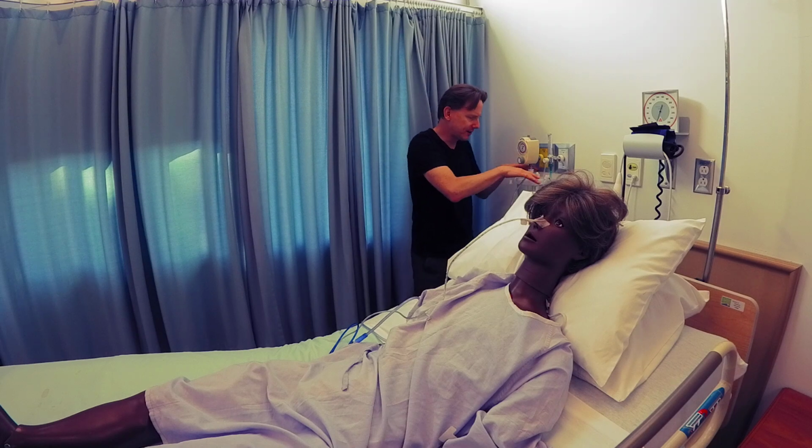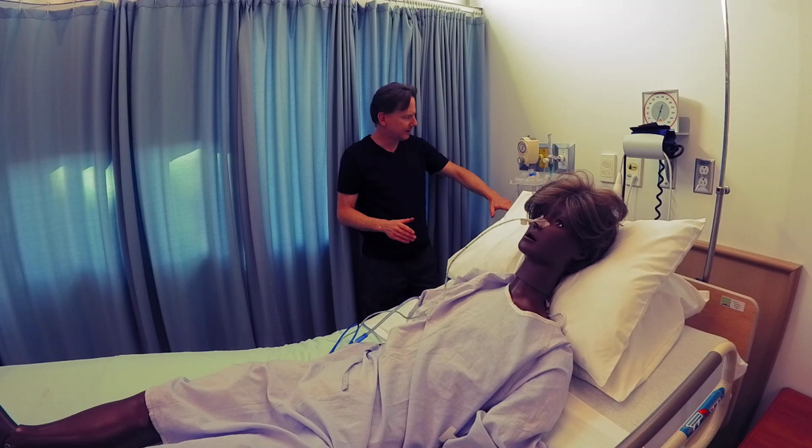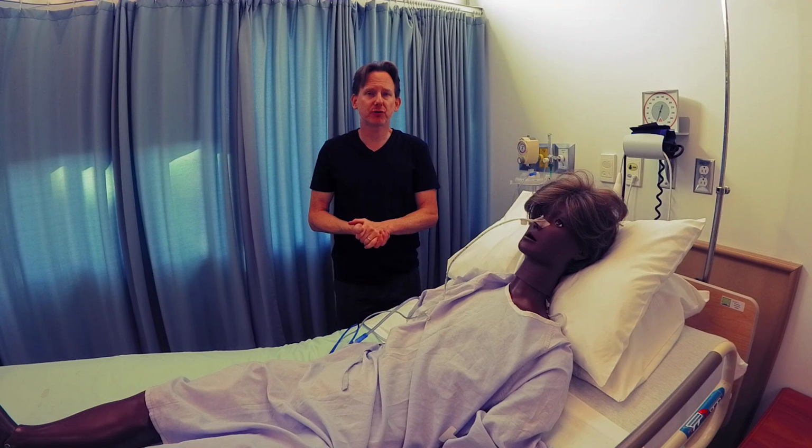Then you're checking to make sure everything's attached. And then lastly, you're looking at your container to make sure it's not getting too full, and you're noting the color and characteristics of the fluid. And that concludes our NG or nasogastric tube assessment.